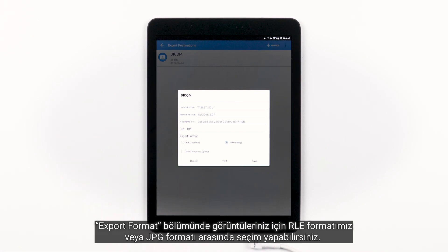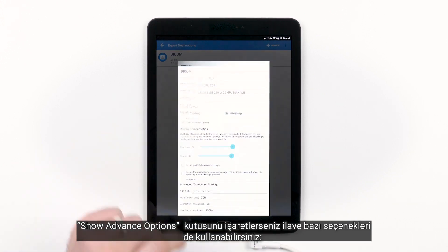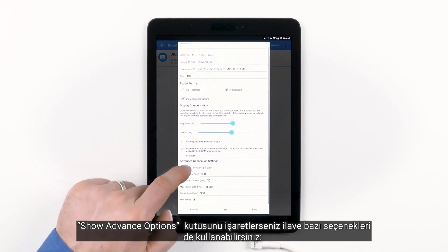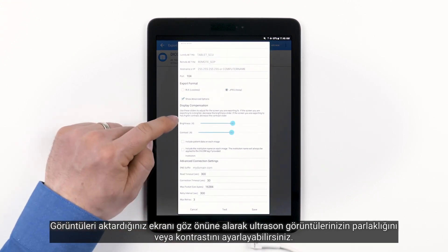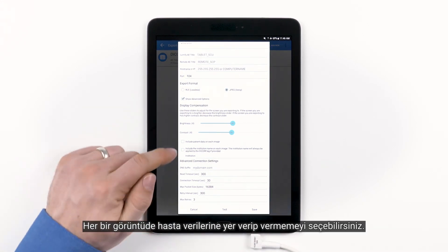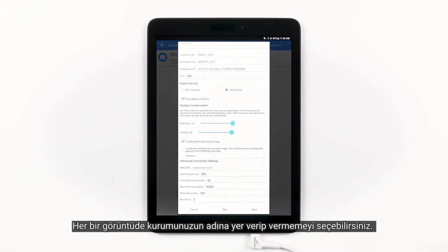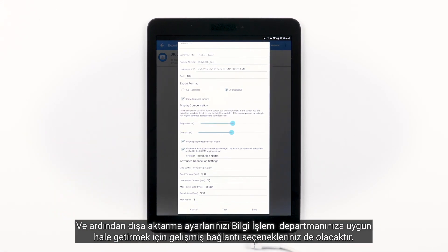In the Export Format section, you have the option to choose between RLE format or JPEG format for your images. If you check the Show Advanced Options box, you will have several other options available to you. You can adjust the brightness and contrast of your ultrasound images to account for the display you'll be exporting to. You can choose to include or exclude patient data on each image, and to include or exclude your institution name in each image.